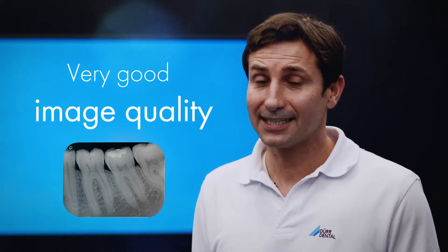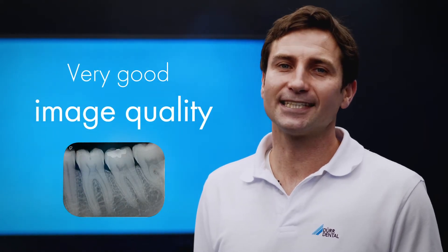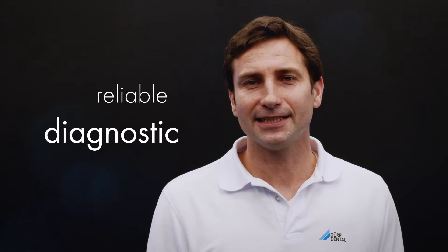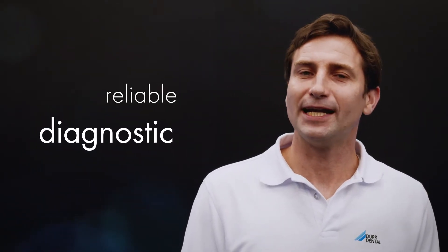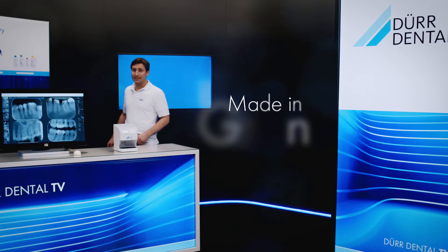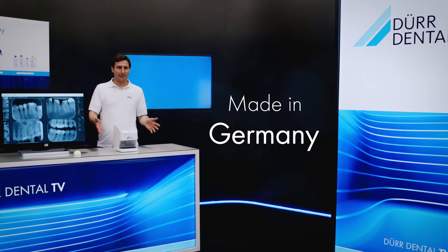VistaScan NanoEasy is a compact image plate scanner that offers exceptional image quality. It particularly stands out with its reliability and ease of operation. Take advantage of Dürr Dental image plate technology in its most compact form for state-of-the-art and reliable diagnostics. The VistaScan NanoEasy is produced in Germany and so delivers top made-in-Germany quality.